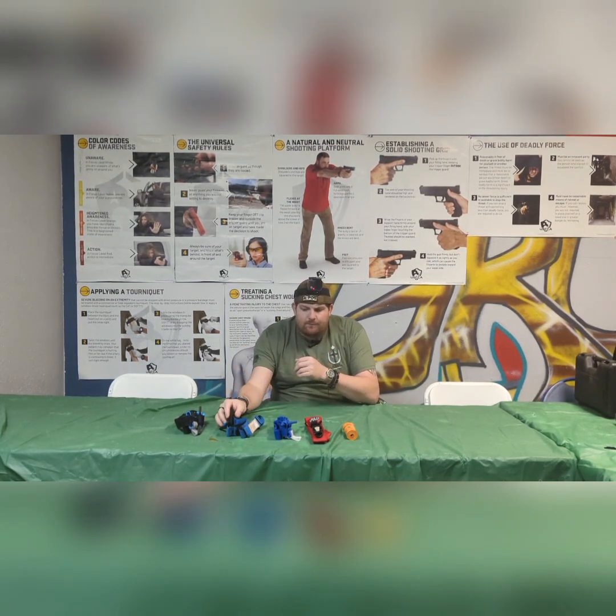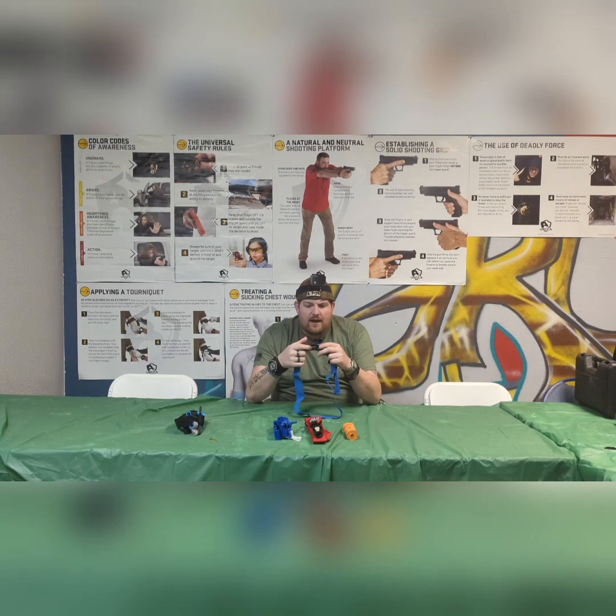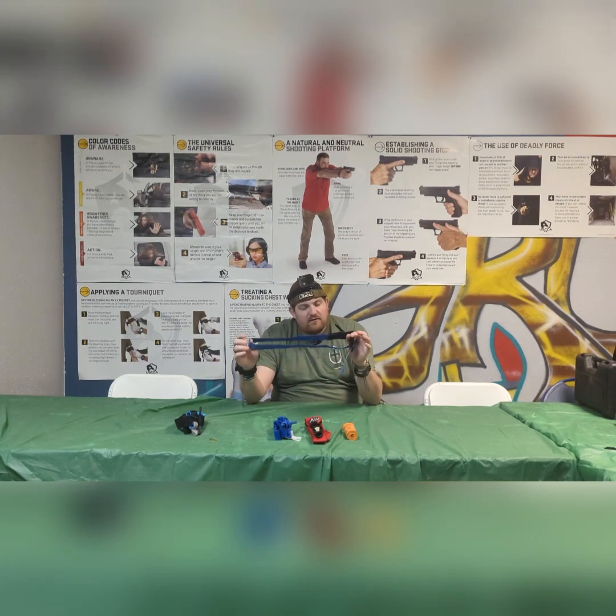The next tourniquet that I fell in love with, or that I was exposed to, was these. This is called a SOFT-T.